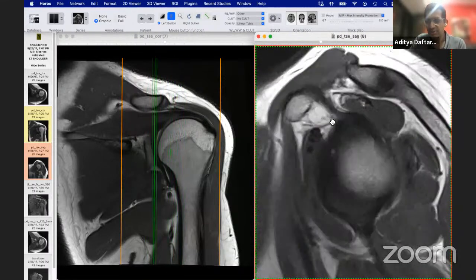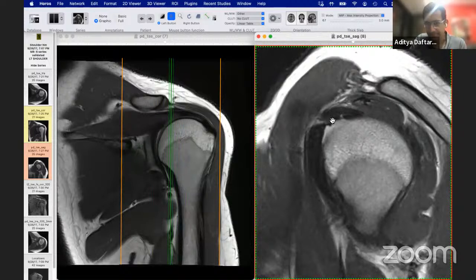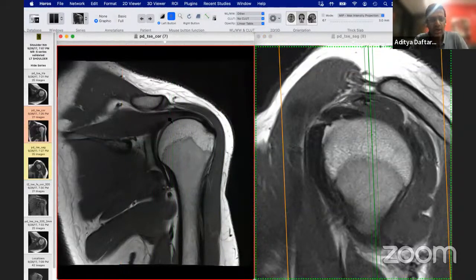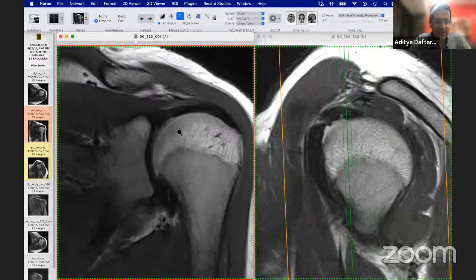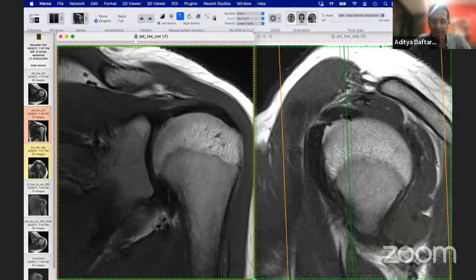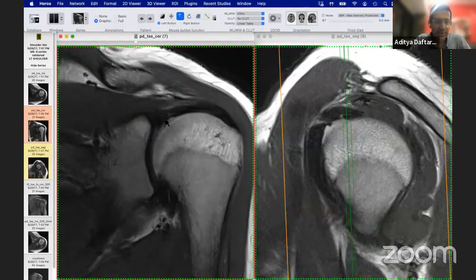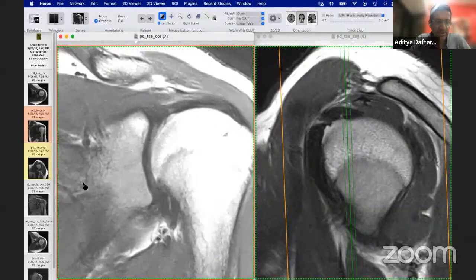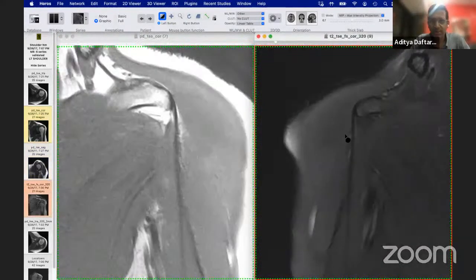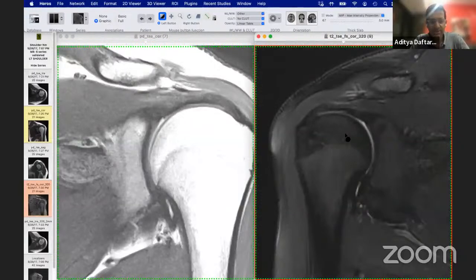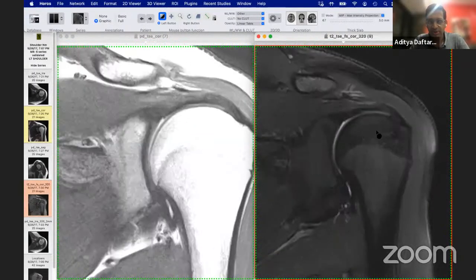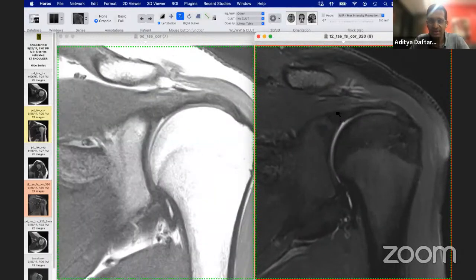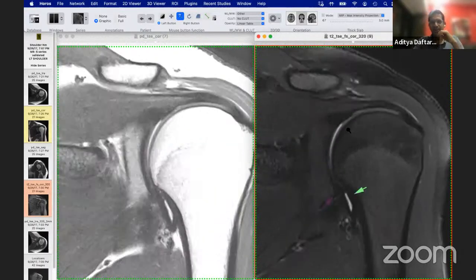On the coronal images, as you scroll, you can see the biceps tendon coming across and attaching to the superior labrum. This is an important structure to look at. The superior labrum on these coronal images should have this black signal. Once we see the superior labrum, we want to look at the posterior and anterior labrum as well.